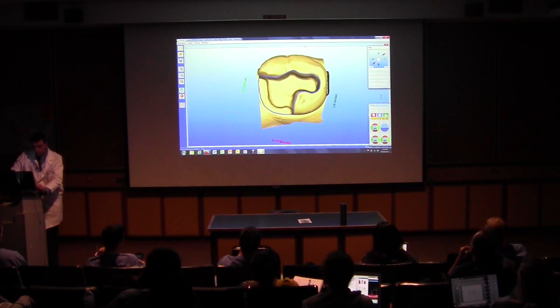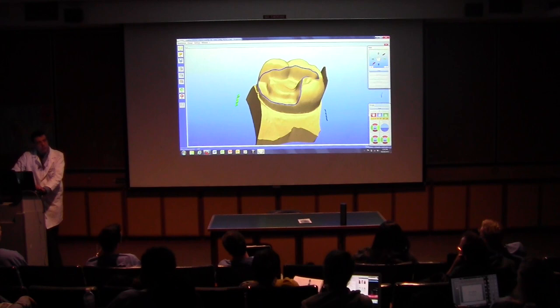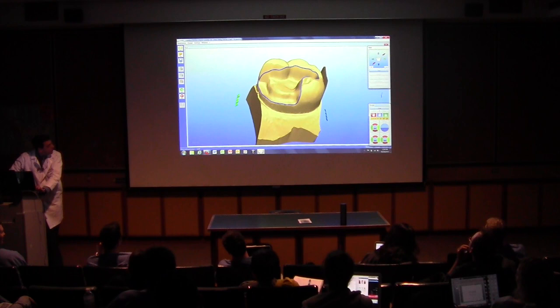Are we done? Well, Dr. Berger, I don't think the margin is correct. Sometimes the computer is stupid, sorry for my French. What you can do is fix the margin. Before hitting next, I'm going to double click here. And guess what? As a dentist, I can tell this machine where my margin is. Once you hit the next spot there, double click again, voila.